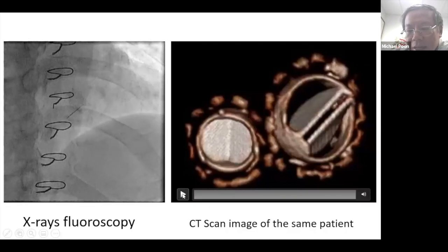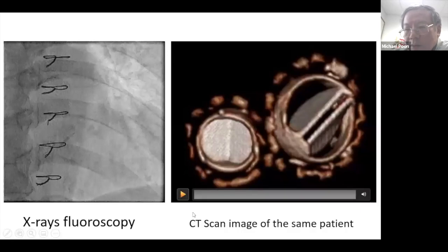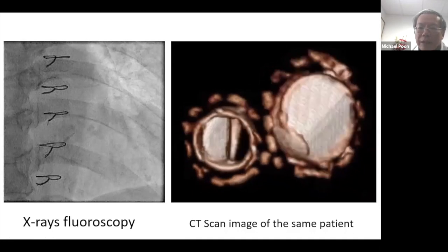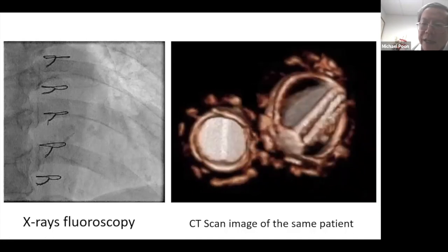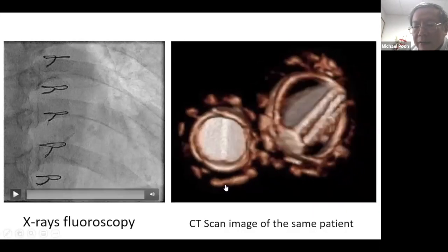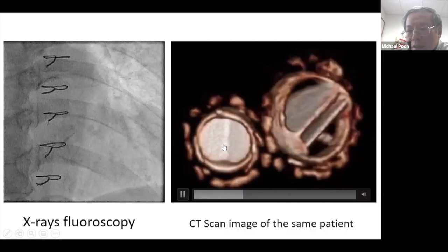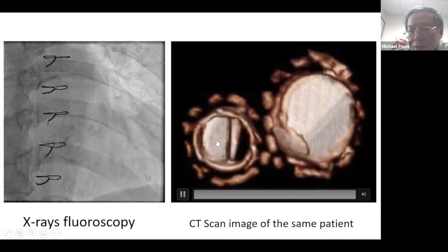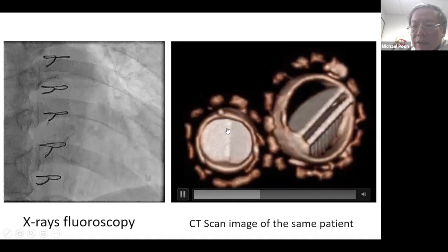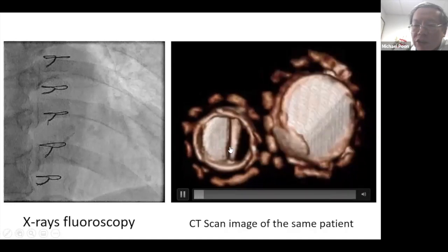And this is a scan that I did last year using CAT scan, and you can see the same two valves in the same individual now look like this. Pretty amazing, right? It's a technology using X-ray, but now you get a 360-degree image of the two valves, and you can rotate it any way you like. If you look at it very carefully, the one on the left is not working properly. One of the leaflets is stuck. That's why this patient is having symptoms of shortness of breath. This patient later on needed a reoperation to replace these improperly functioning valves.